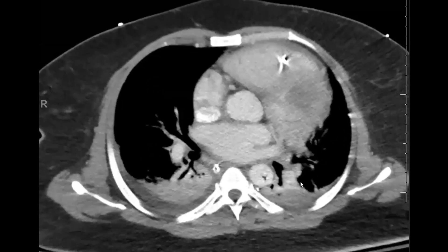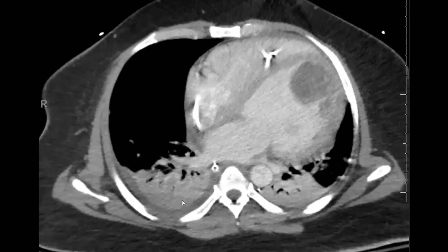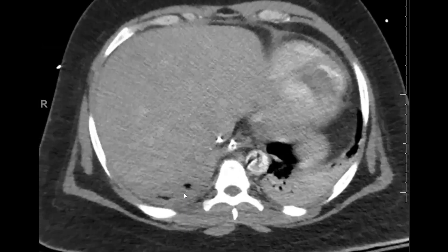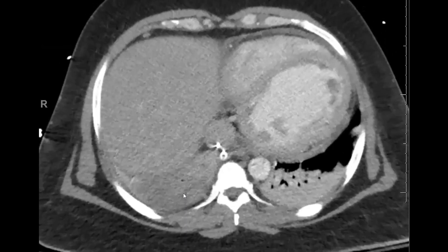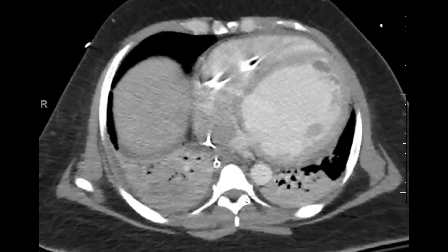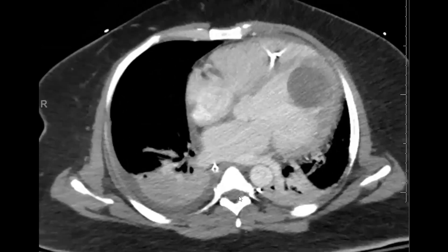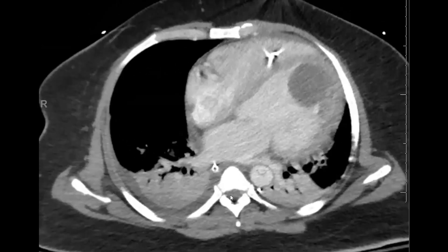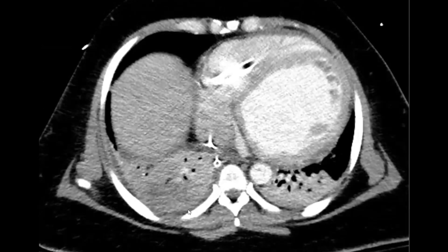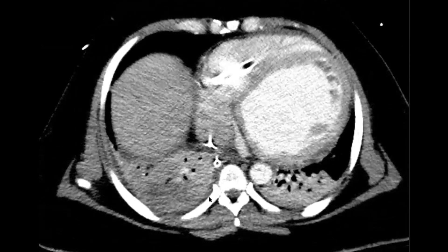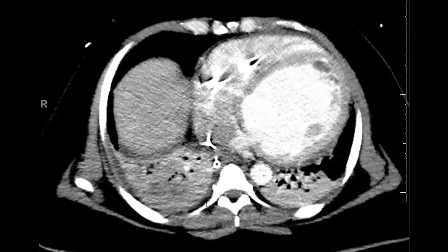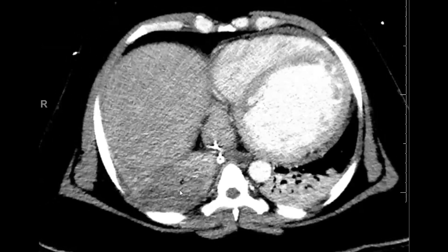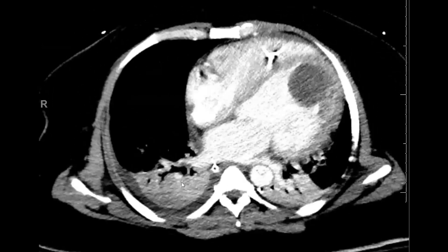Quick case here. This patient had some cavitary infection in the right lower lobe with some necrosis. Clearly has some bibasilar atelectasis as well with small right pleural effusion. If we were to window it, there's a nice example of an infiltrative abnormality superimposed on atelectasis.